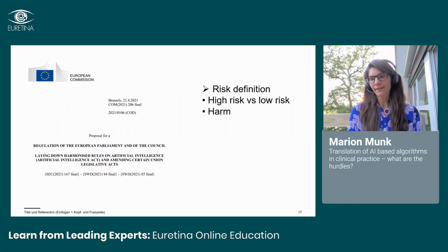And this is also, like I said, why many more algorithms, especially screening tools, are available in the EU and have this CE mark when compared to the US. However, so far, there is no billing code for the EU, which means that some countries reimburse telemedicine or screening tools, but most of the countries do not.